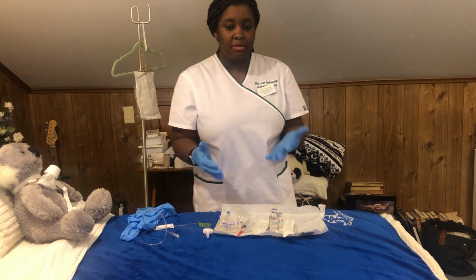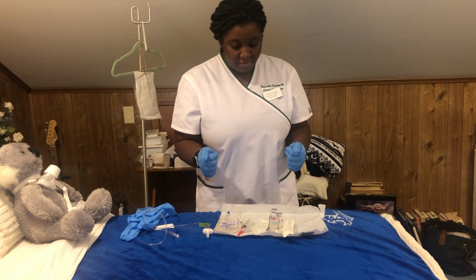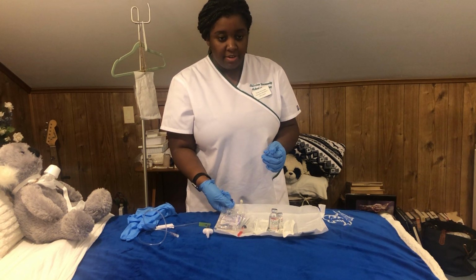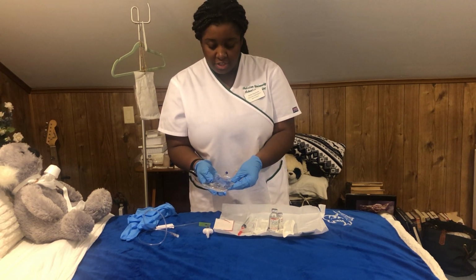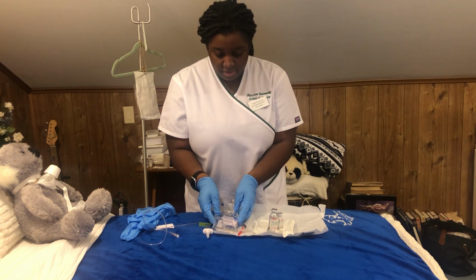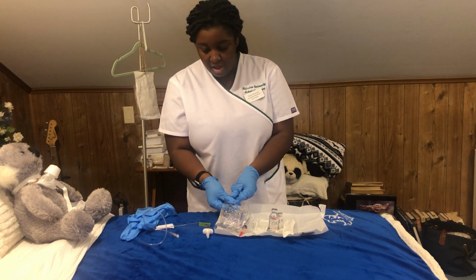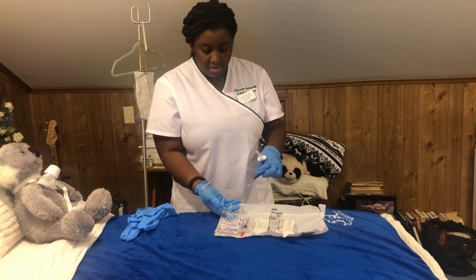So we've already established what the medication is for. It's an antibiotic to treat the urinary tract infection, and so I will just move on. Okay, so I will then remove the protective cover. Having the solution lie flat, and while I was in the medication room, I made sure that the medication was distributed evenly, but I'm just doing so now again to make sure that it's all even and it's all diluted into the piggyback pouch. I will then remove the blue protective covering from the pouch and attach the IV piggyback link to this.